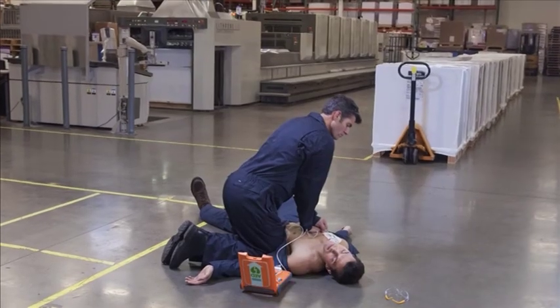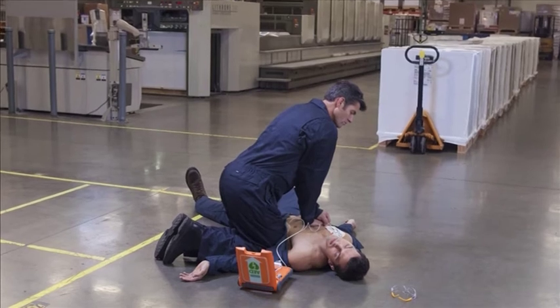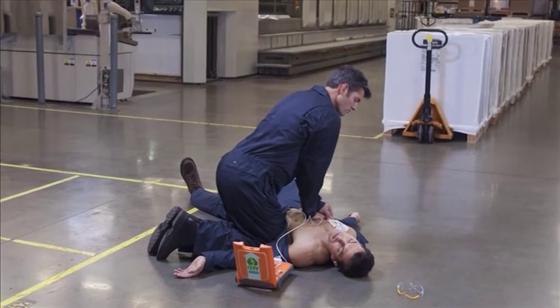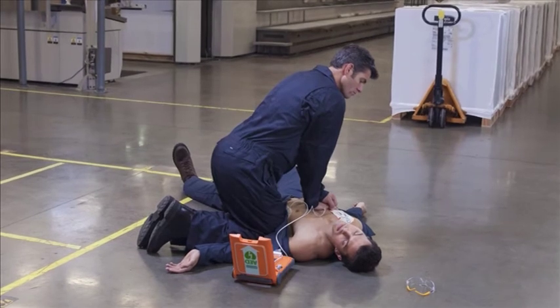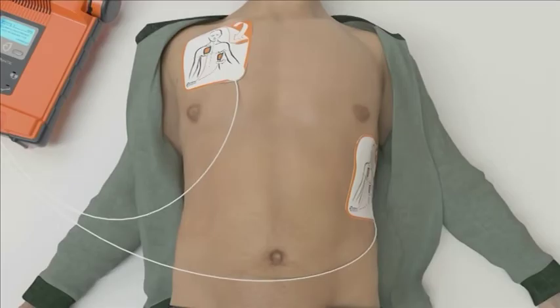If there is no green package in the lid with the CPR device and only standard electrode pads are connected, the AED will still guide you through how to perform CPR, along with the metronome for 30 compressions as well as the 2 breaths. The only difference is that the AED will not give you feedback during CPR. Once the CPR cycle is complete, the G5 analyses the heart rhythm and delivers additional therapy if necessary. Leave the electrode pads on the patient until the ambulance arrives.